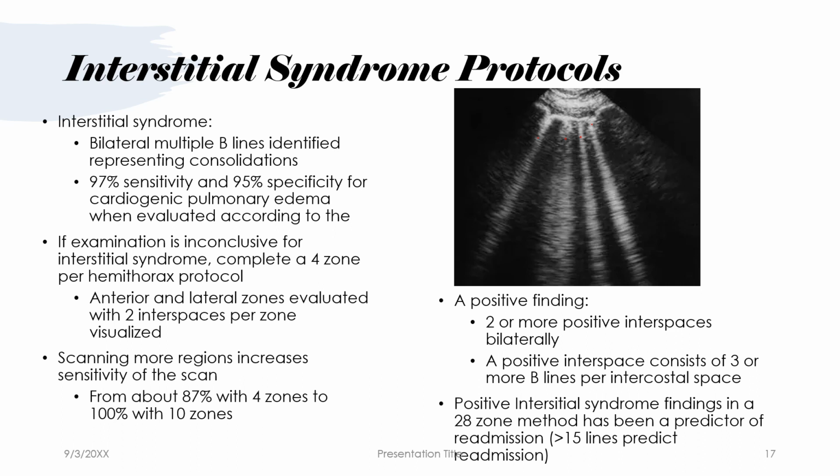When we look for interstitial syndrome, it has a 97% sensitivity and 95% specificity for cardiogenic pulmonary edema when evaluating according to the current protocols and findings.